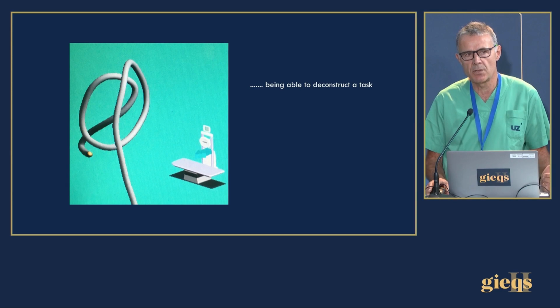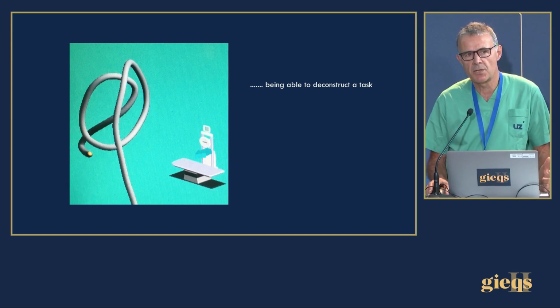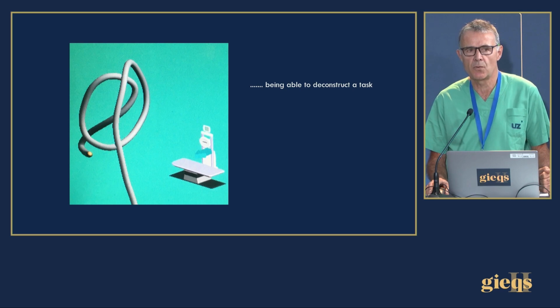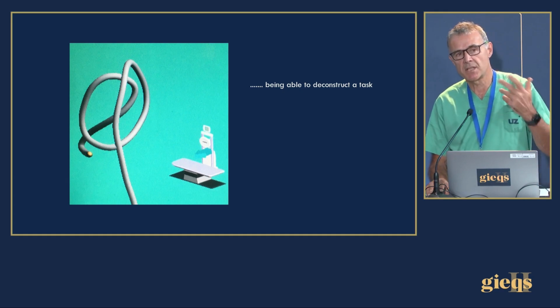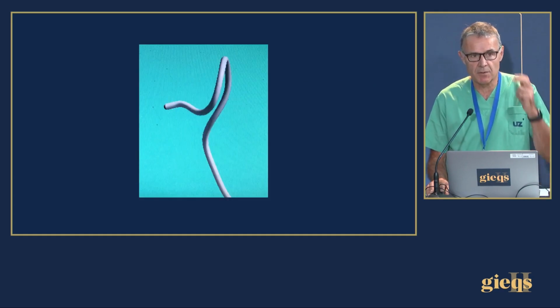I know that there are two loops in the sigmoid colon. I know that I need to reduce the size of each loop before resolving them with some clockwise torque. And I know that all the movements need to be done very slowly. And because there are such big loops, I know it's very unstable.